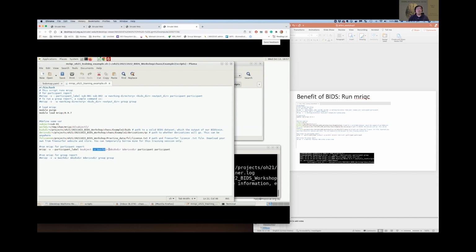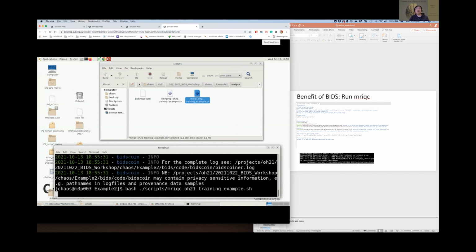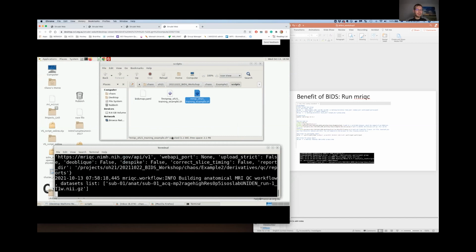And then you have the working directory, the input, the output, and tell it participant level. And you simply run it. To run a script, just bash the script for MRIQC and press enter. It will run.